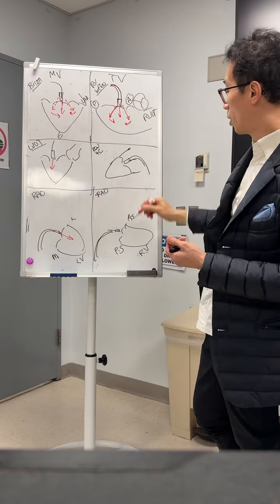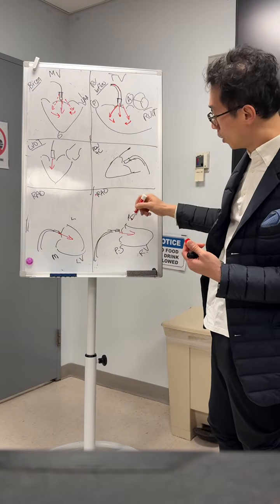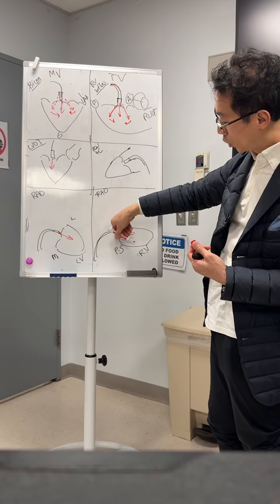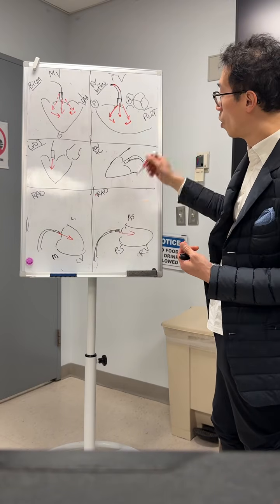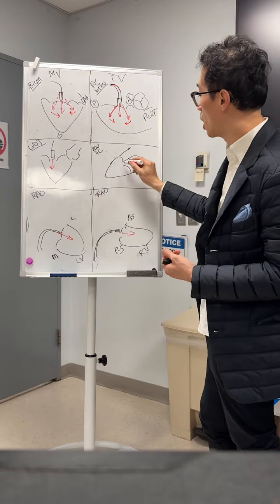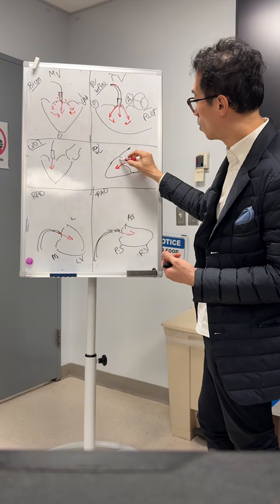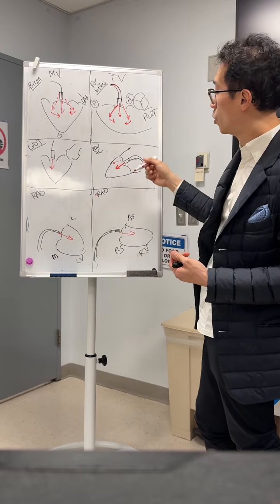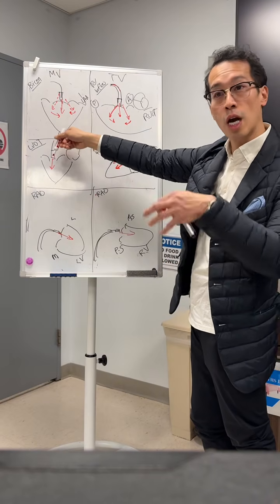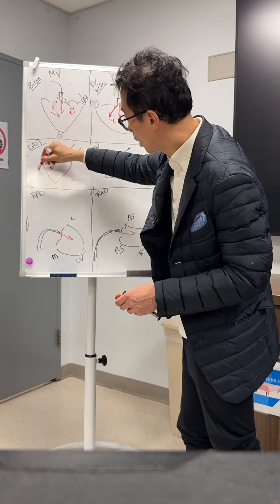Here, the same thing, looking at this. So you want to go in a perpendicular manner. If you're going towards the anterior septal commissure, you'll flex more, and vice versa, you flex less. This will not tell you whether you're going towards the septum or the lateral. To do that, you need to be able to see this and be able to go in straight. If you're going more septal, you would counterclockwise the guide. Kind of like here, if you're going posterior, you counterclockwise the guide to go anterior. So if you're going this way, you counterclockwise the guide.